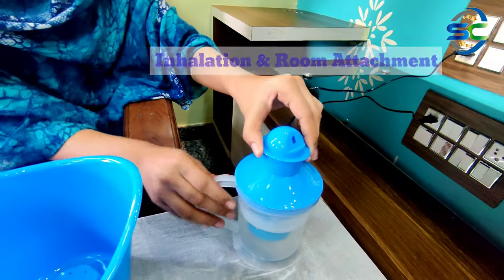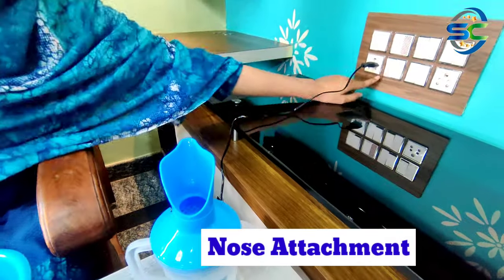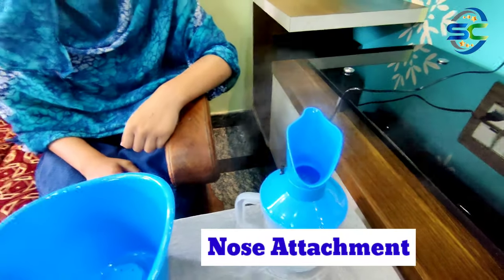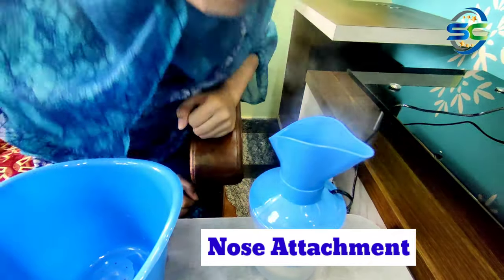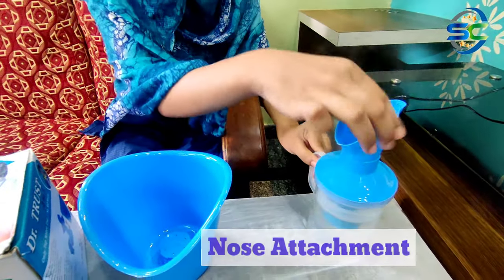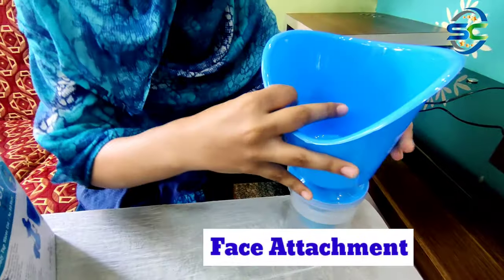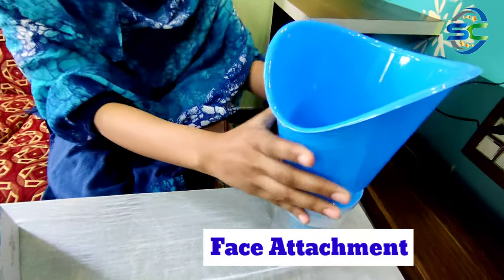The next attachment is for the nose. We will fit it and take it directly to the nose to inhale the steam.